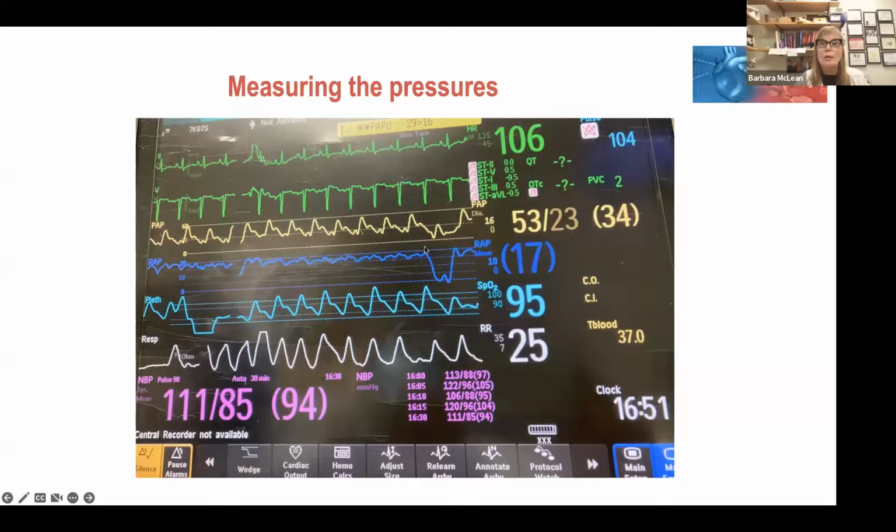But if my patient is on APRV or pressure control inverse, this will be all inspiratory pressure, and I need to read down here. So look at the difference. Here the pressure is 0, and here your pressure is around 17 or 18. That's going to mean a lot to a person who really understands ventricular compliance.